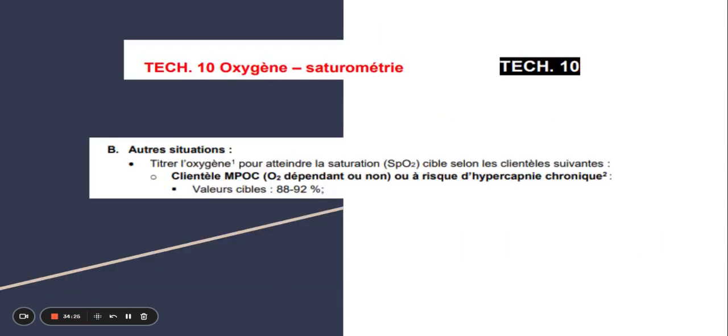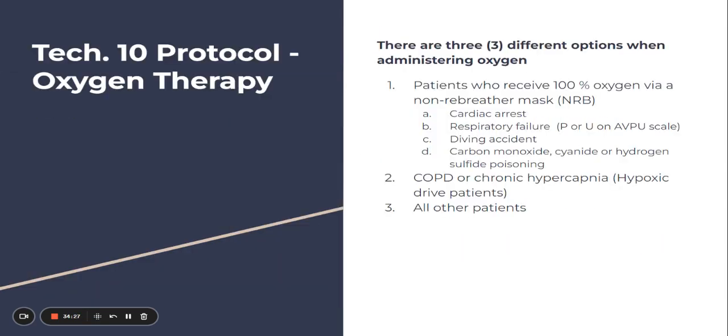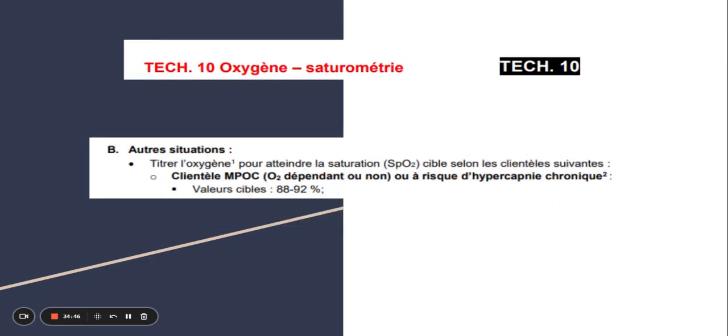So let me just go back here too, because I want to specify for patients who are not COPD, who do not meet one of these 4 criteria, the saturation we're looking for is 94 to 98%. Okay, so I'll say it again, 94 to 98%.